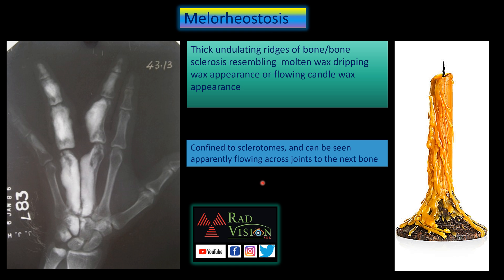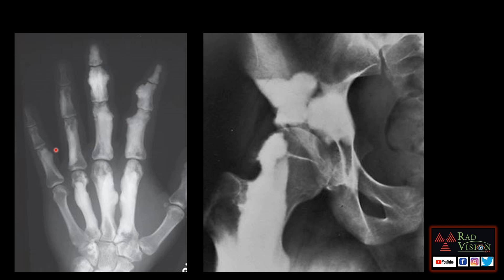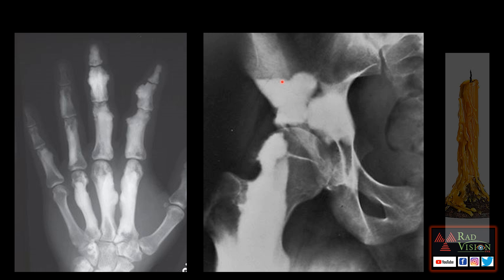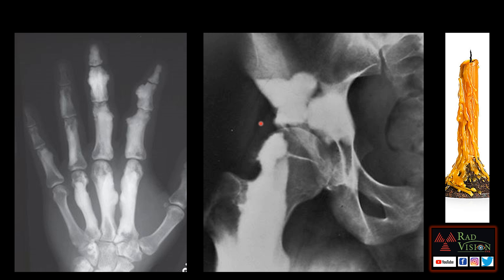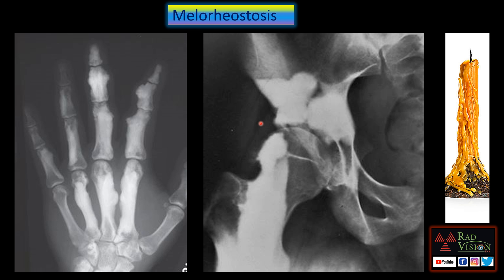This is the classical case of melorheostosis. Other cases of melorheostosis also show thick undulating bony sclerosis in a sclerotomal distribution crossing joints — here involving the femur, crossing the hip joint, involving the acetabulum and pelvic bones, mimicking the candle wax appearance.